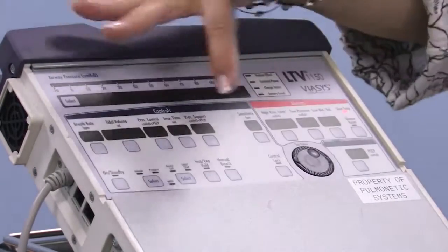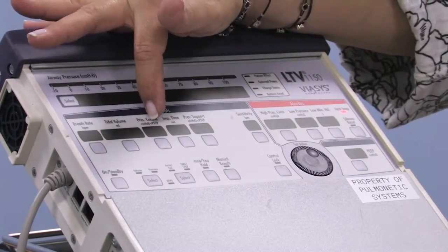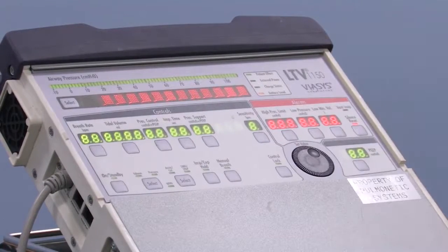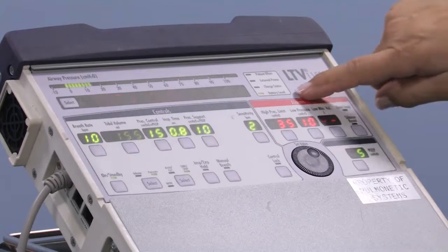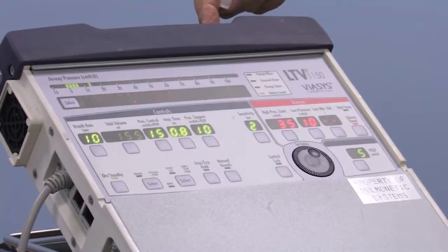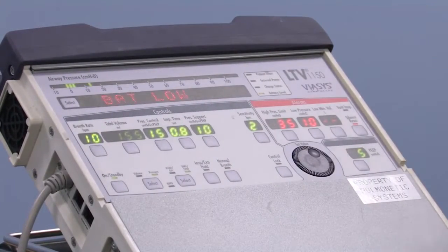So when I turn this machine on, you're going to see that this one, even though it says pressure control plus PEEP, pressure support plus PEEP, it doesn't say that on the other machine. When we turn this on, so see, we've got battery low and we've got amber in the window. So we are on the internal 1-hour battery. It's telling us it's low and it's amber. So I need to plug something into it. I didn't plan this, but it worked out very well for our video.